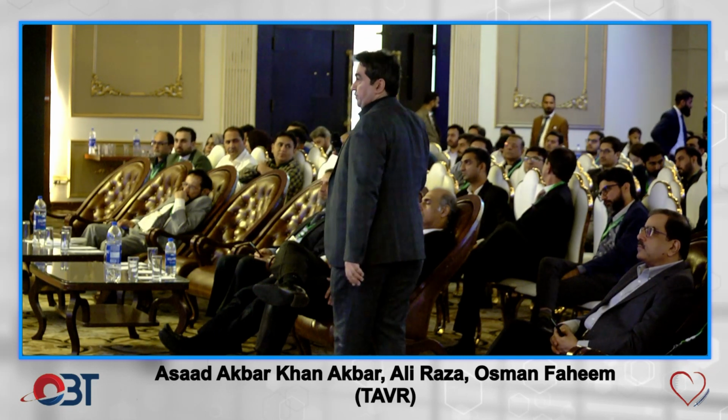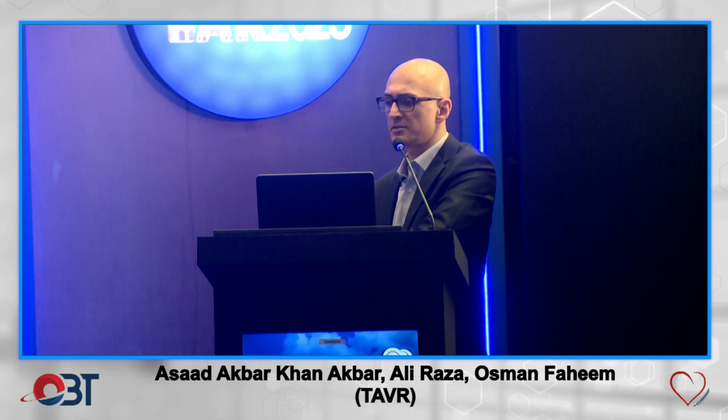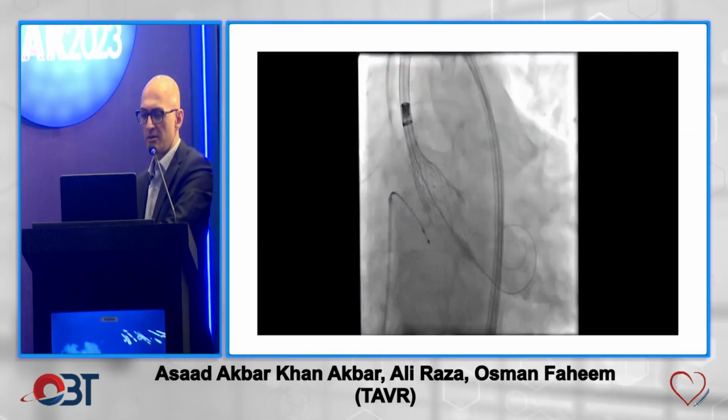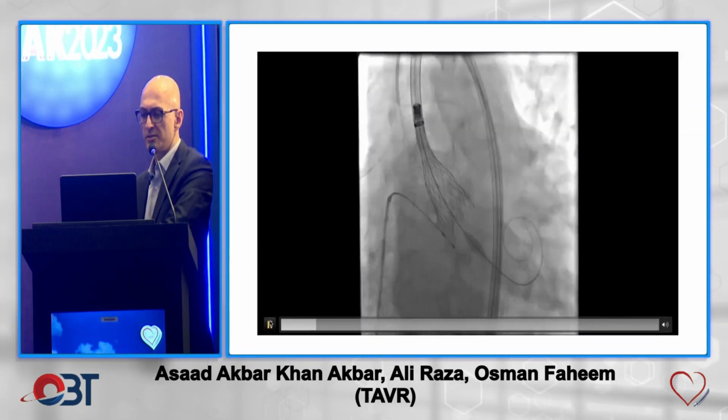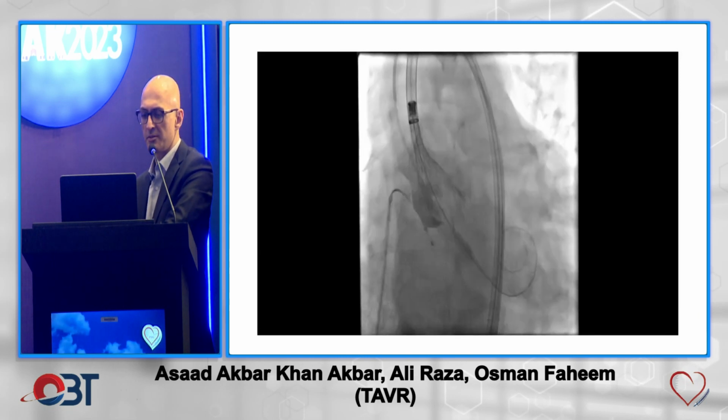All right, so we're pretty happy with the position. We use 50-50 contrast for our injections to try to minimize the contrast. That's why the dye amount is not a lot. So at 2/3 deployment, this is kind of where we ended up. So what does everyone think?